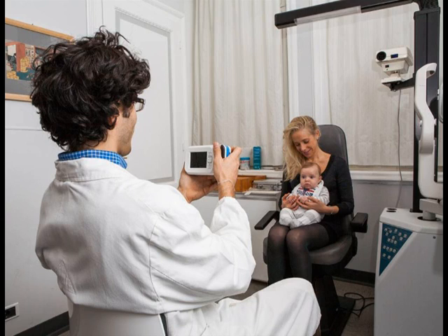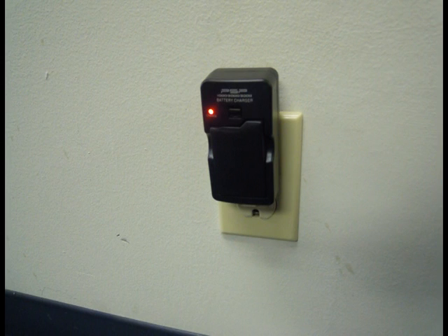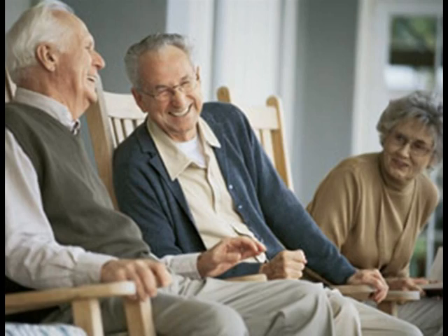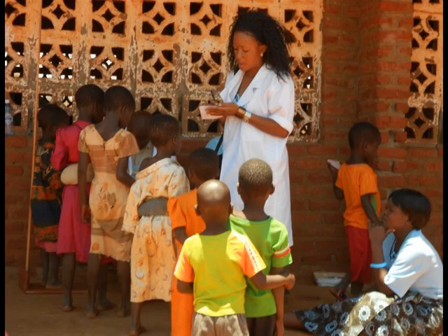The 2-WIN is easy to use, portable, battery-operated, and makes a great tool for your daily practice, as well as in the field at school screenings, nursing homes, workplace screenings, and on charity trips.